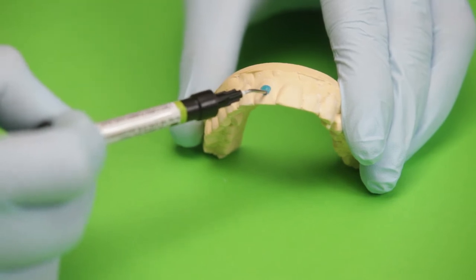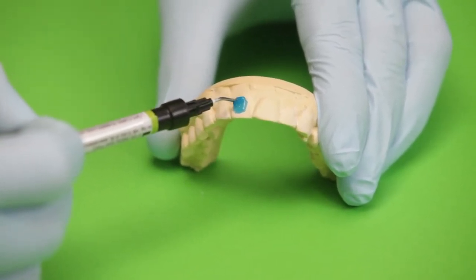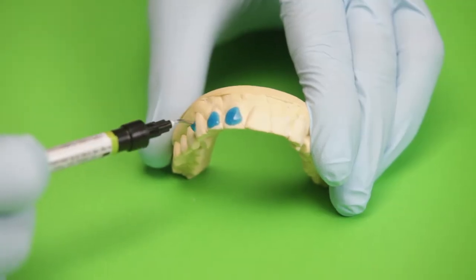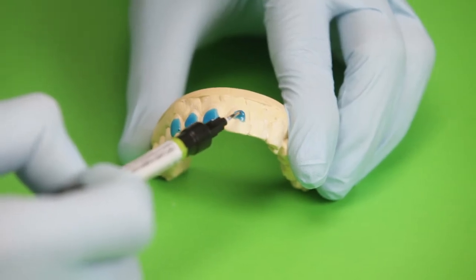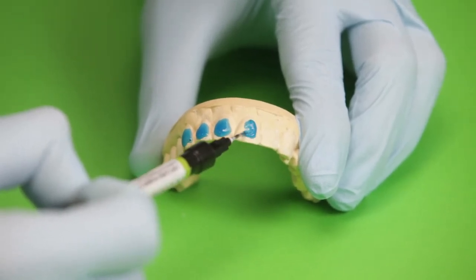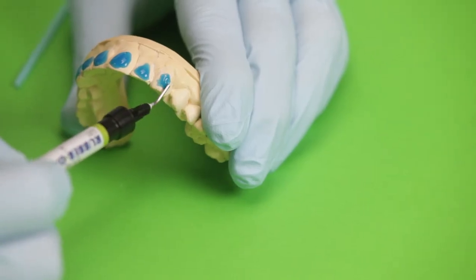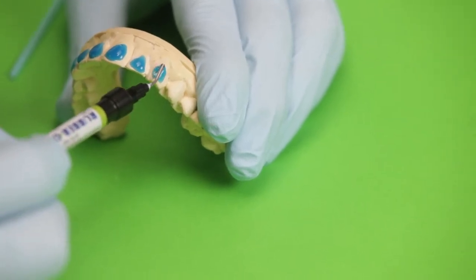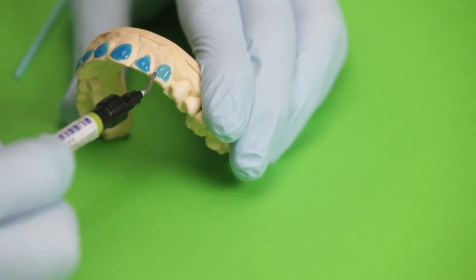We can then begin adding some blockout resin onto the labial surfaces of the teeth on the dried cast. This will help create a reservoir or space for bleaching material to be held inside. It also prevents direct contact of the tray with the teeth, thereby preventing any forces on them. Notice that I am a good millimeter short of the gingival margin and the incisal edges. This is important as you don't want any bleach to contact the gingival tissue.